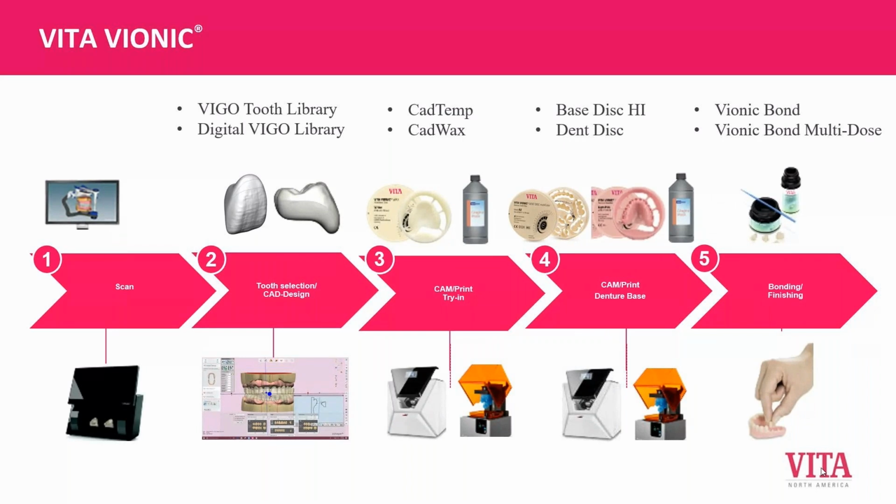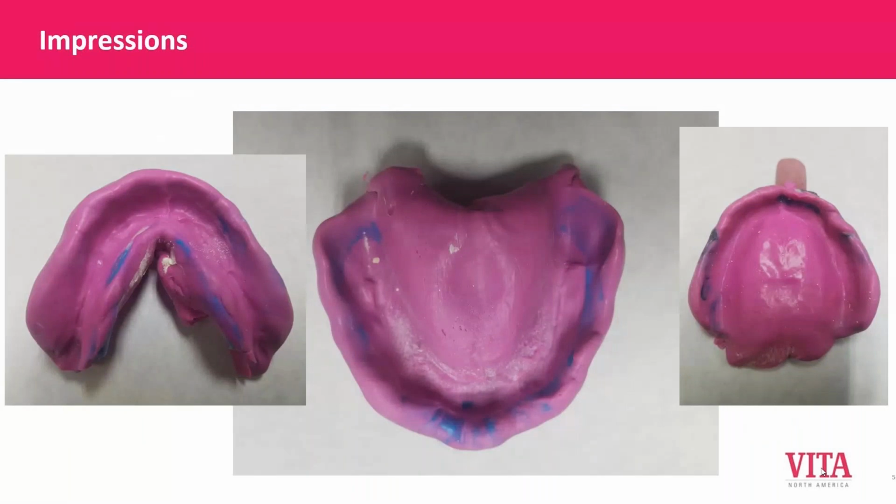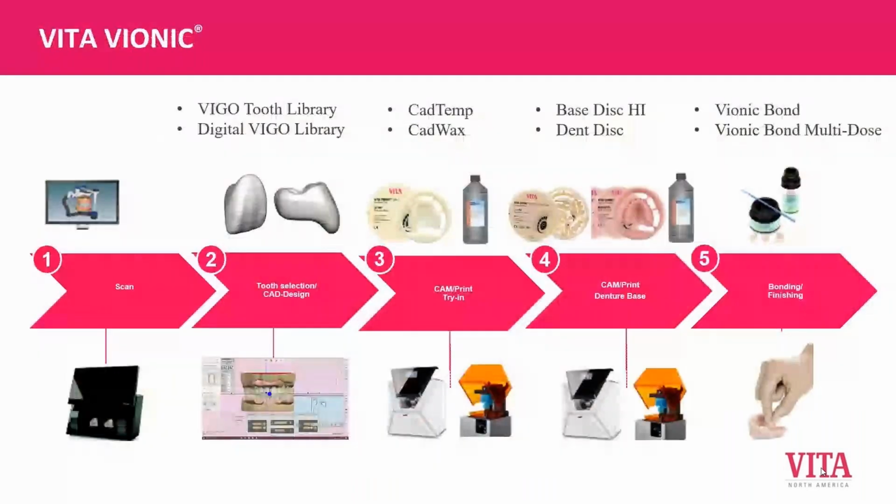I'm going to jump up here and talk a little about that, because that first piece, getting that information into the computer, is really the most important part of this, which is actually taking good records. I usually say complete and accurate records. That's a discussion between you and your clinician, or if you're a denturist, you can look at yourself and your own techniques.